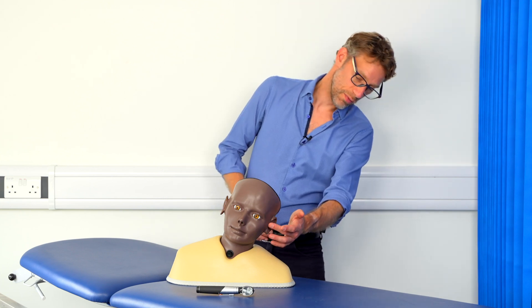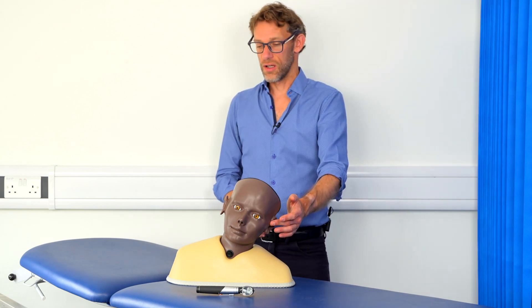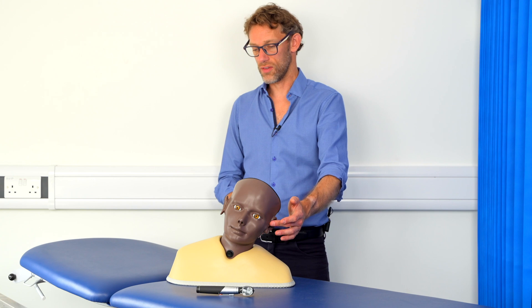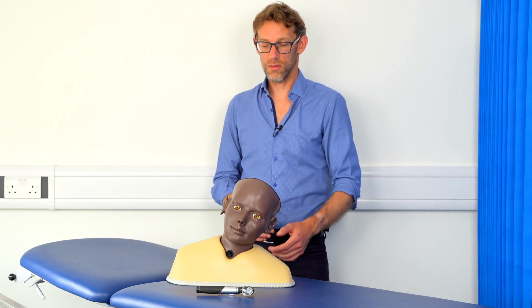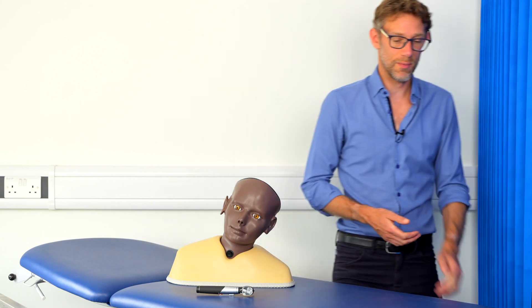And we're going to do the same again on this side. So pressing over the tragus, 472D. Great. So we don't appear to have any abnormalities to the hearing.